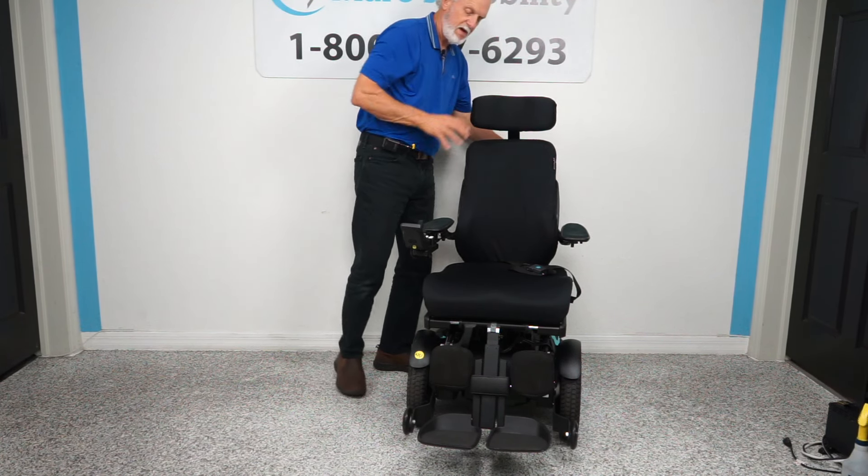I want to show you how this chair turns on itself. If you're in the house, this is your turning radius — and if you look at this room, it's a 12 by 12 room. That's your turning radius.